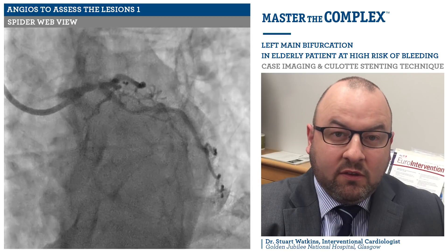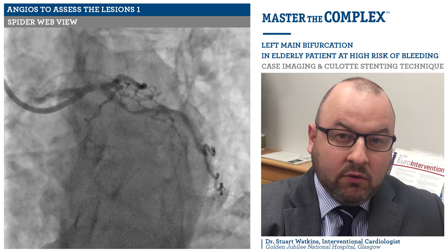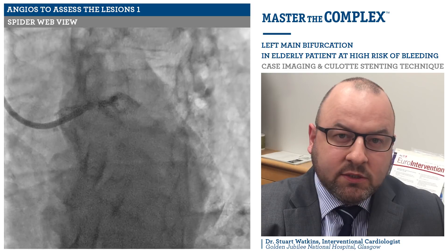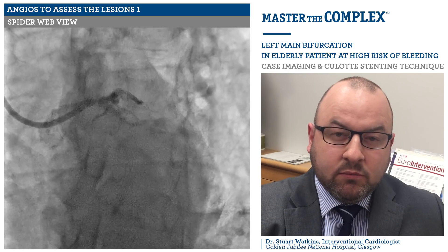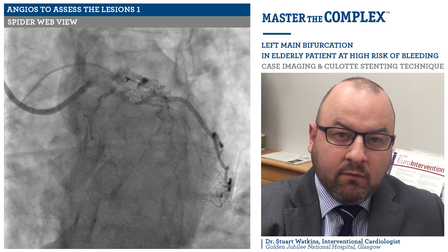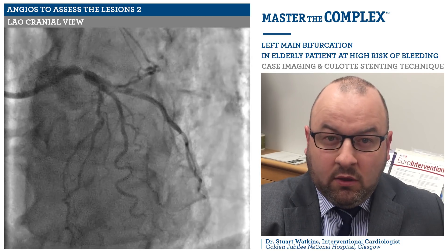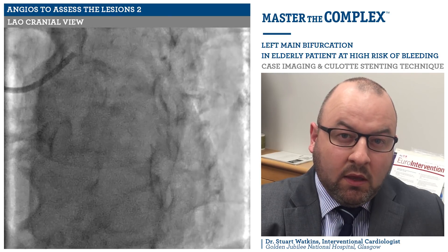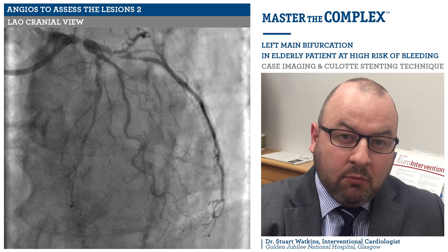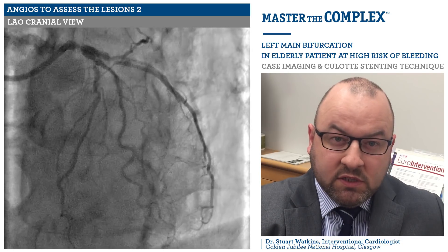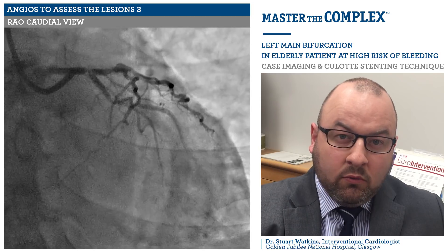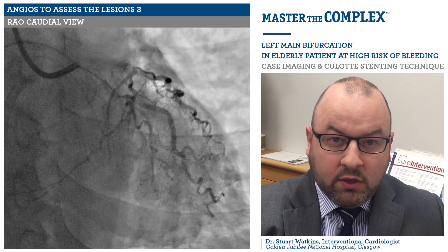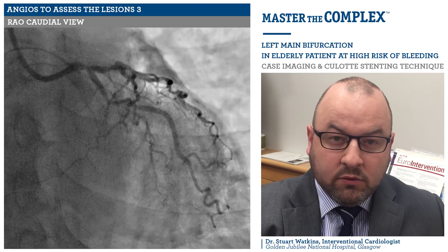This gentleman's angiogram was undertaken from the right radial approach. On the spider view you can see he has a tight distal calcified left main stem bifurcation stenosis, and he also has severe disease in the obtuse marginal branch of the left circumflex. On the LAO cranial view there is severe disease in the proximal LAD, with a large first diagonal branch which looks relatively free of disease. On the RAO caudal view you can see that the distal left main stem bifurcation stenosis is truly a Medina 1,1,1 stenosis.